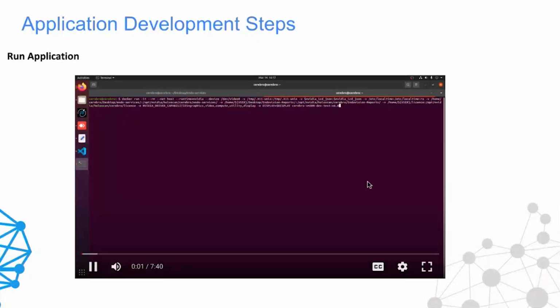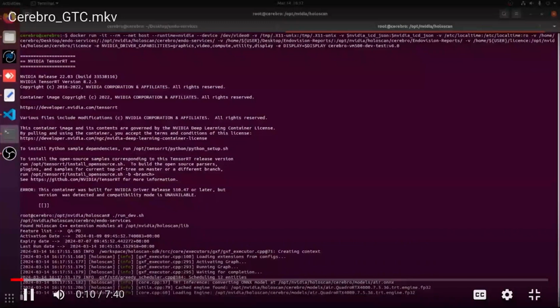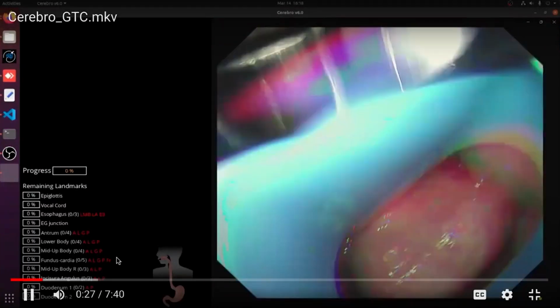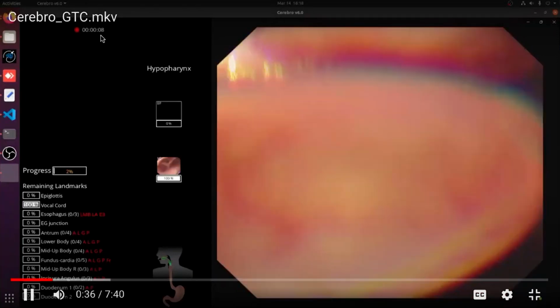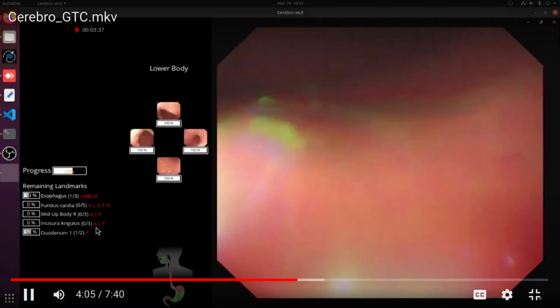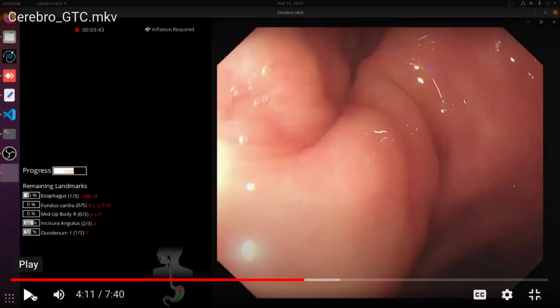So this is the sample application that we have just created. We are going to run this within the Holoscan Docker environment. Over here you can see on the left hand side the objects that we have overlaid on top of the feed that is coming on the right hand side. As soon as the doctor enters the patient, on the top we see the timer has started and different landmarks are now getting qualified. This is basically the same demo that I showed you, but now it is built with Holoscan, and you can see the user interface is a bit different as well. Moving on.